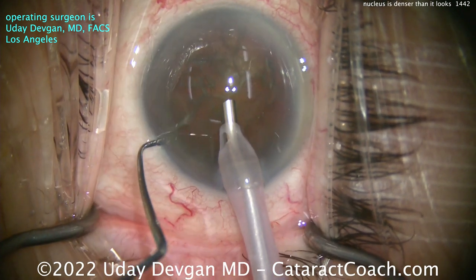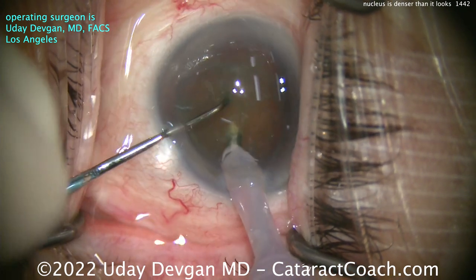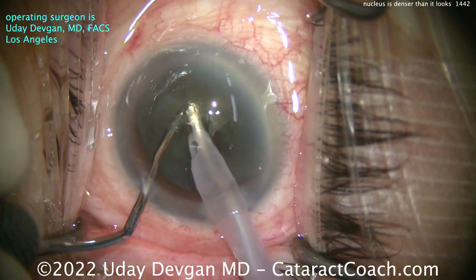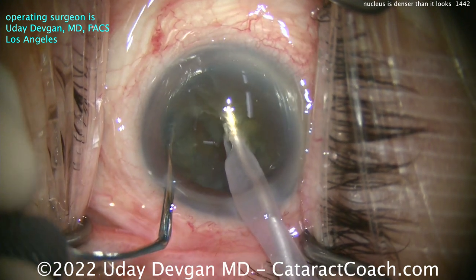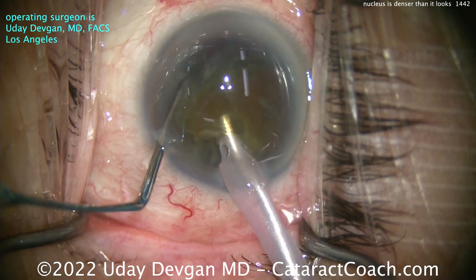Good draping, eye in primary position, eye beautifully centered — everything looks pretty routine. Buzzing with the phaco probe. And here's where I tell the density as I put the chopper through. Whoa — it's got some fibrous nature to it. Look, the pieces don't want to separate. So I really have to put some effort in to really propagate that chop across to make sure we have two separated pieces.